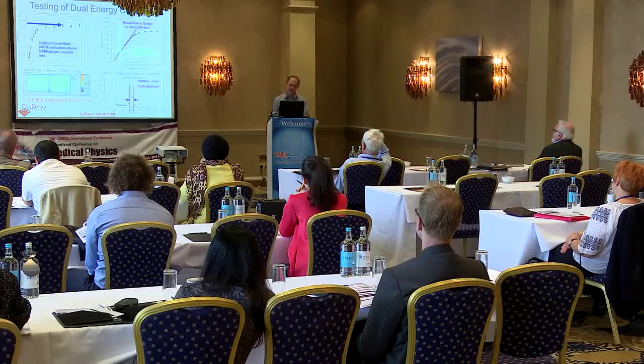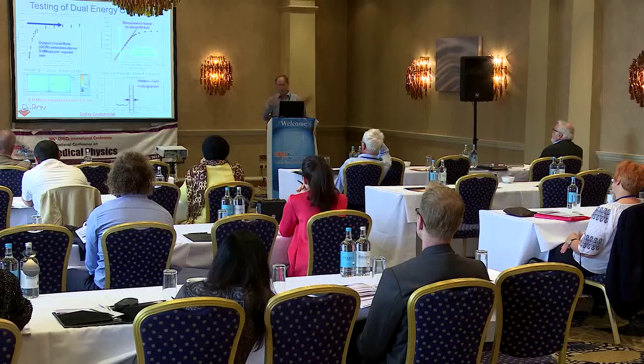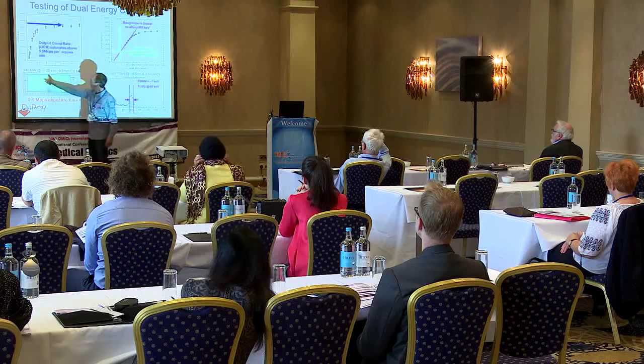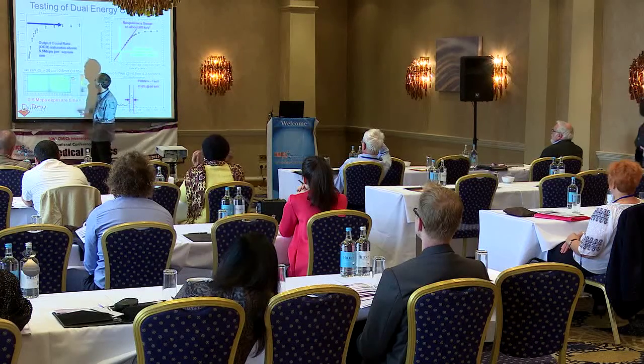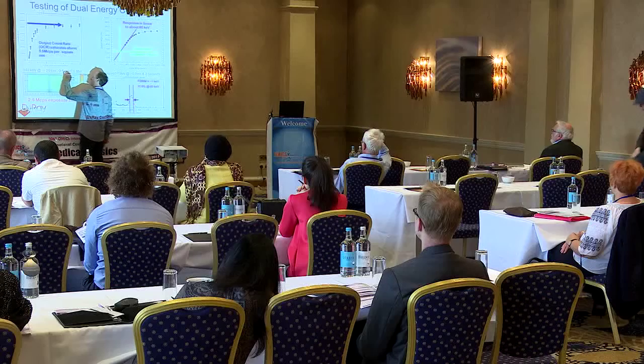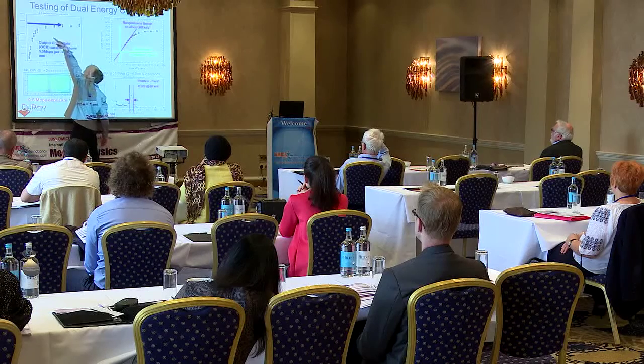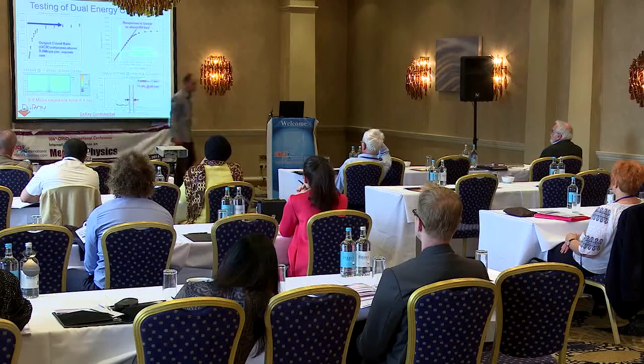Here shows a field of view, a flat flood uniformity for one particular module, and if you'll notice that there are less counts in the pixels that are around the edge, that's because I make the pixels that are around the edge smaller than the pixels in the center, so that when they're tiled together, the small gap that's between modules will not disturb the preserved pixel pitch across the entire field of view.